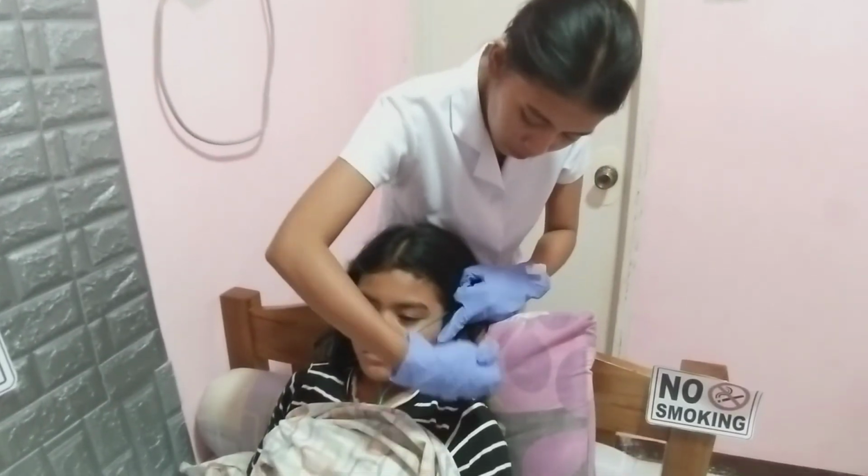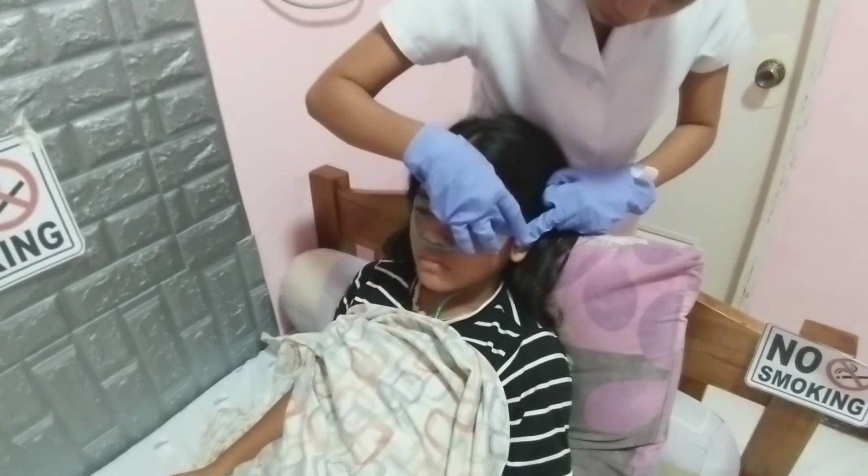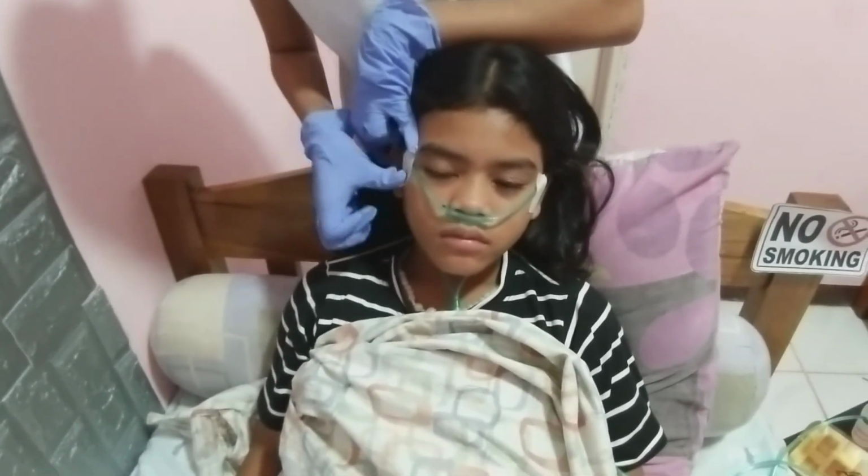If the cannula will not stay in place, tape it at the side of the face. This is to secure the tube or cannula, especially the prongs inside the nares, to prevent dislodgement. This is for us to secure the tube and also to prevent the tube from being dislodged.